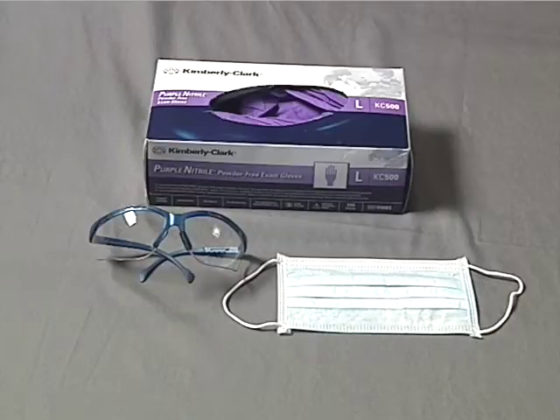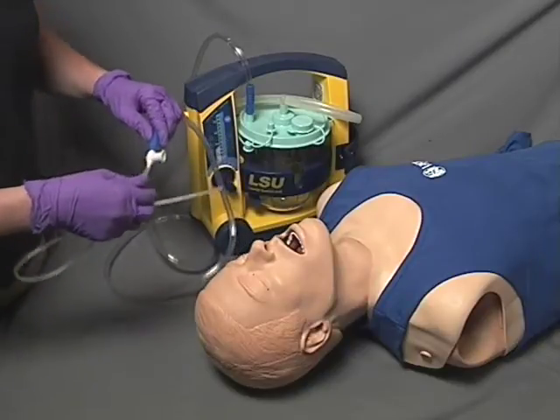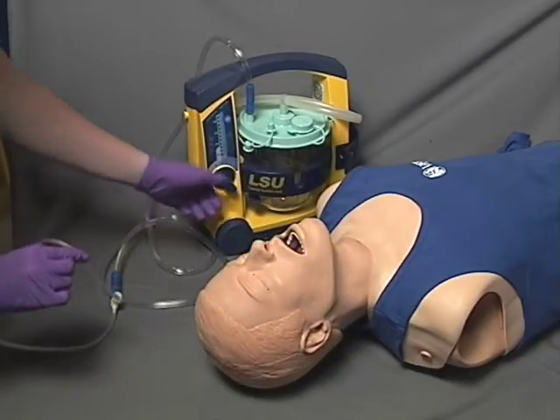When using a flexible tip suction catheter, it is necessary to measure the catheter against the patient to suction at the correct depth. First, attach the catheter to the suction device and then measure the catheter from the tip of the patient's earlobe to the corner of the mouth to determine the correct insertion length.